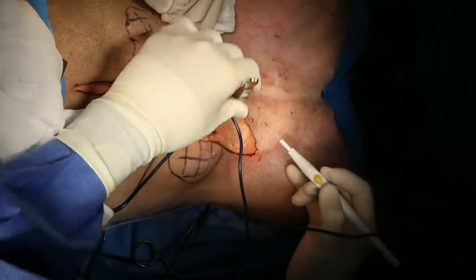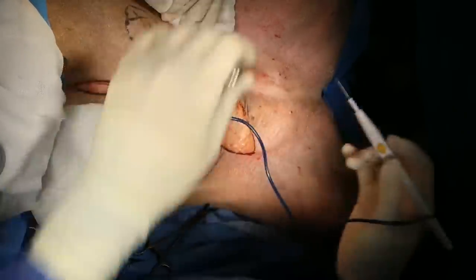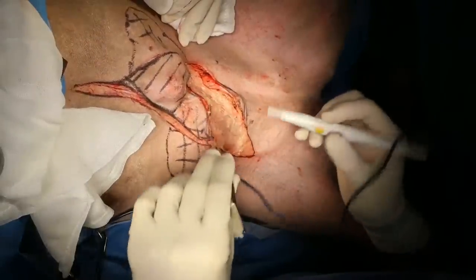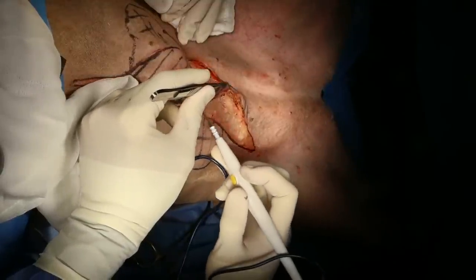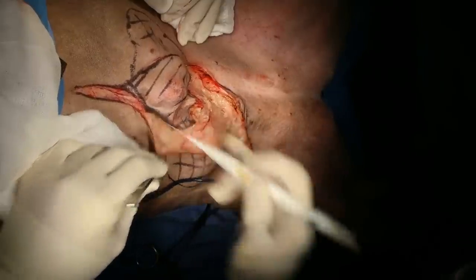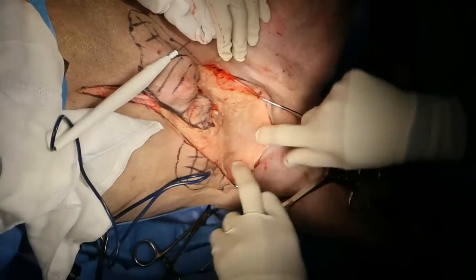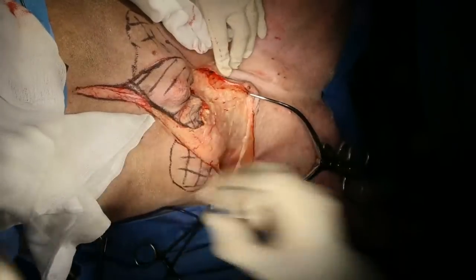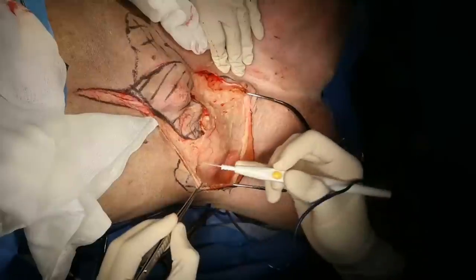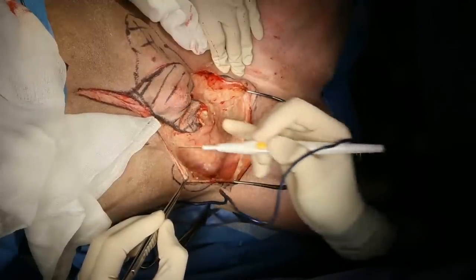The CT scan on this case is pretty dramatic. Can I get cautery turned up to 40, please? So you can see the rectus fascia over the mass there. That's why the skin could be preserved, because the mass is actually of the muscle rather than subcutaneously. And when you look at the CT scan, you can see that the tumor extends into the abdomen.